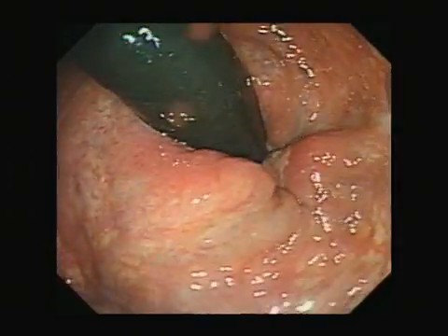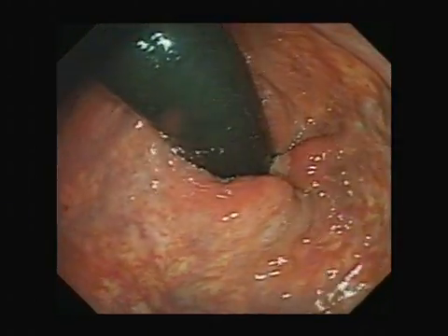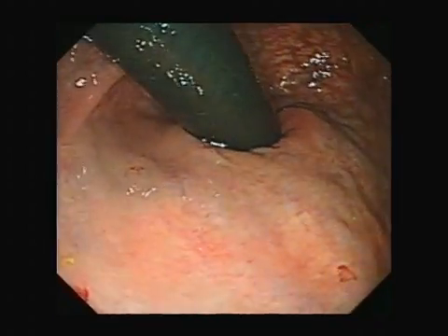Now, to skip back to the other end, even with a normal anorectum, the rectal veins can be very prominent, even tortuous.